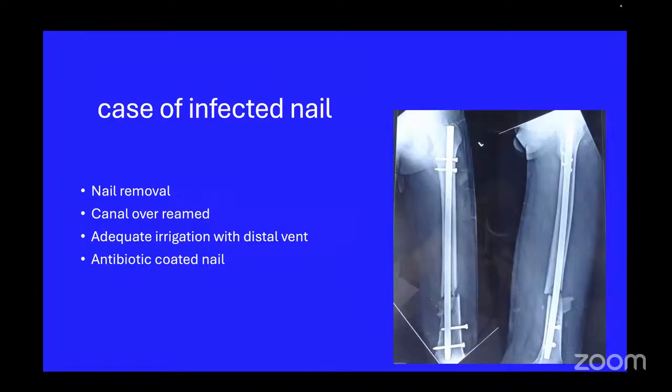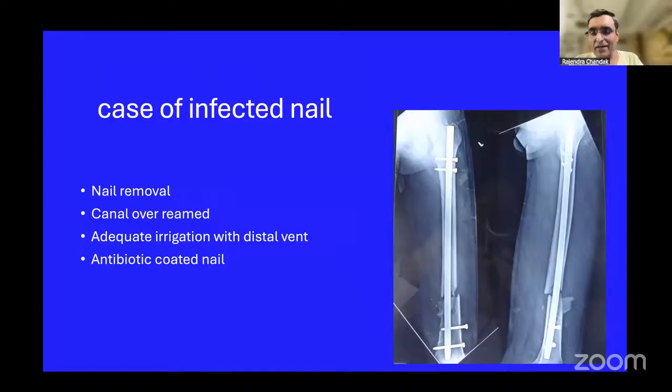Distal femoral nail, sir. A multi-lock distal femoral nail should have been done. Retrograde. Yes, a retrograde distal femur nail was a very wonderful choice in this case. But in case he gets infection with a distal femur nail, now how would you like to manage? That is also a possibility. Acute flare-up of infection after a distal femur nail. So in that case, would you like to tackle it with removal of implant, or go ahead with maintaining the implant? These would be the questions in mind.